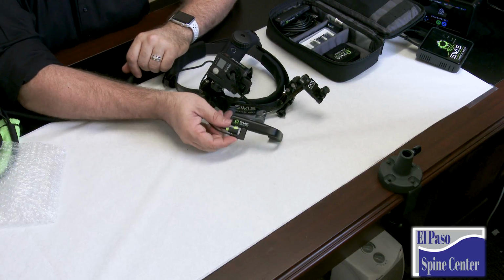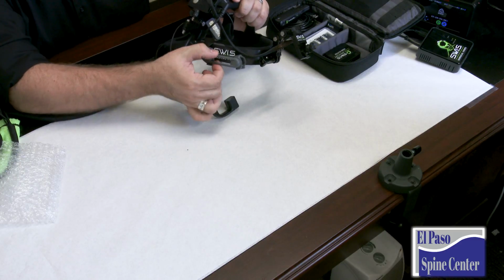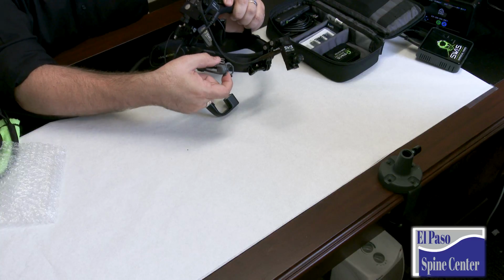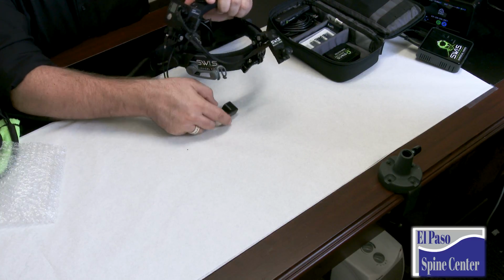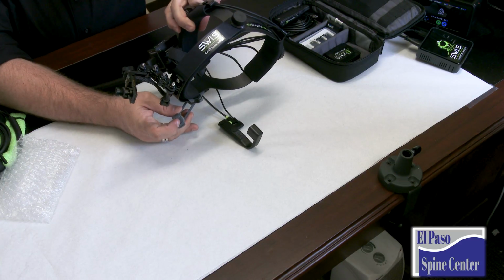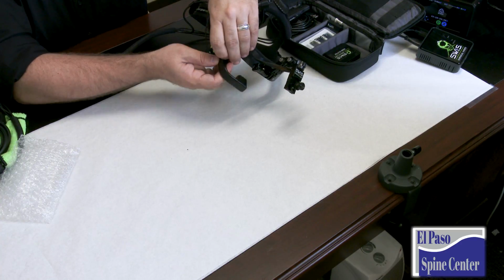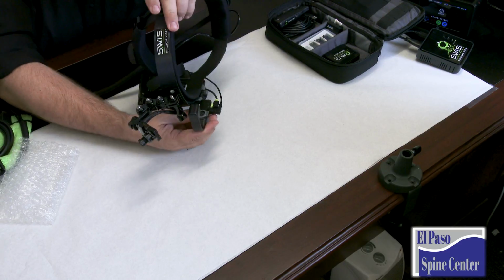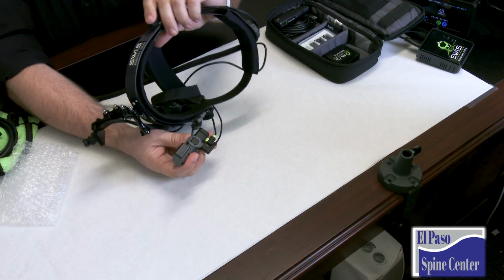And you get a system that looks kind of like that. Now, this isn't just a hanging system. Remember this gray mount? This front part actually fits the viewfinder. There's a little circular knob inside of the viewfinder, and there's actually a hole inside of the headgear. So that circular mount for the viewfinder will fit right over that hole. It should pop right into place.